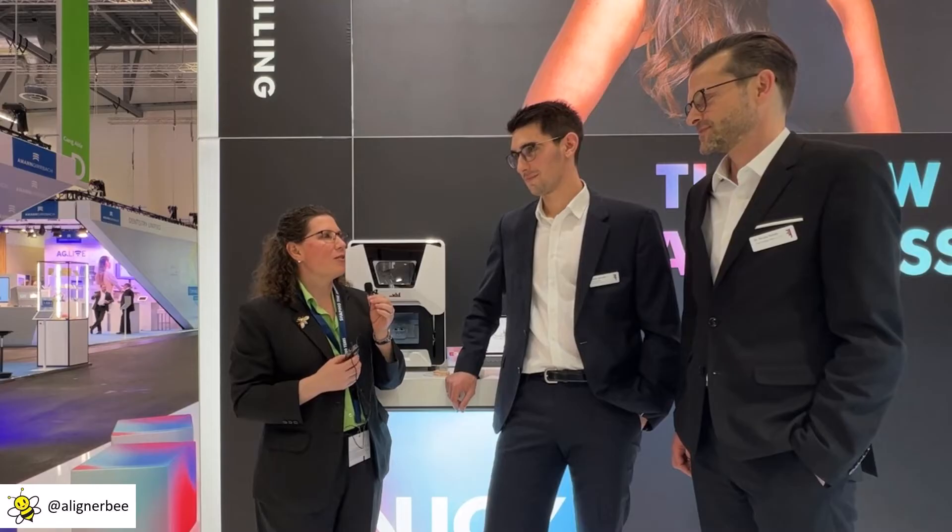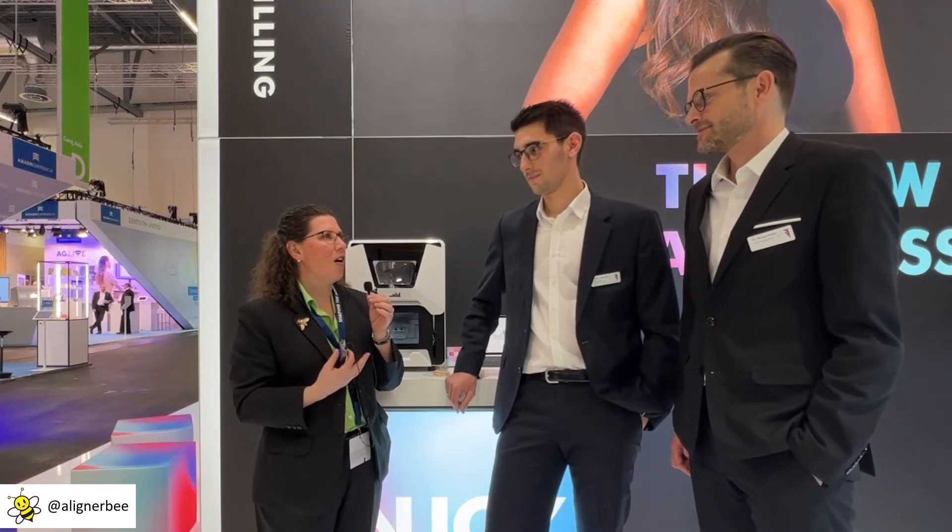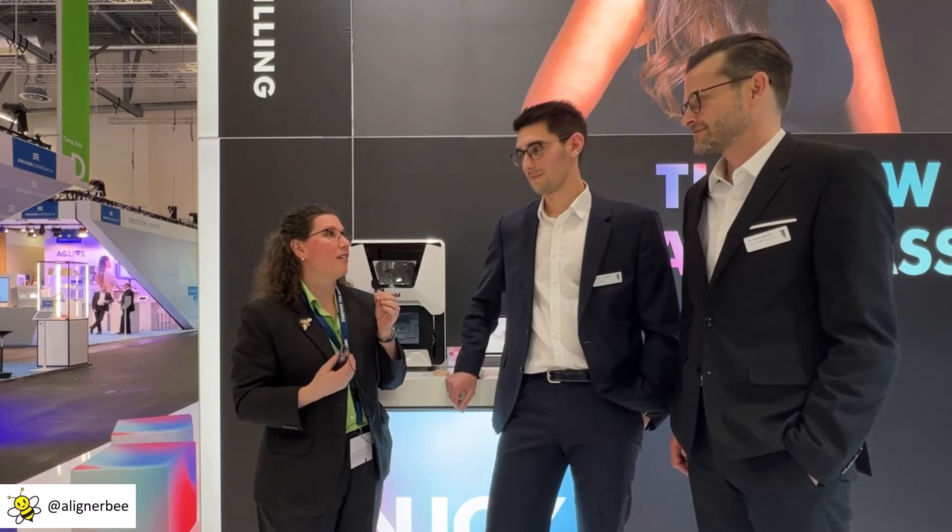Nicholas, what would you say are some of the strongest points for adding the E3 to an in-office laboratory or a dental laboratory? First of all, it automates part of the process that has been repetitive and tedious. As Fabian showed, the machine is as easy as can be, it fits in every practice with a small footprint, and last but not least, it comes at a very attractive price point.